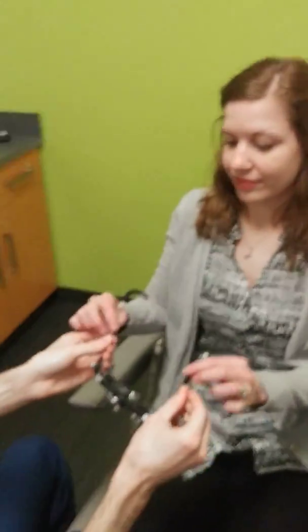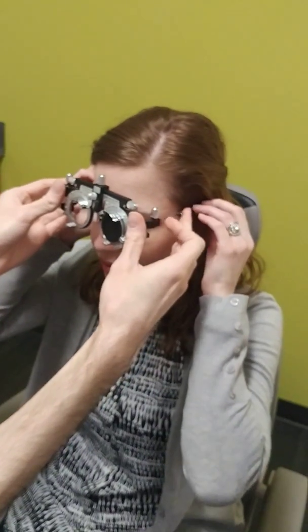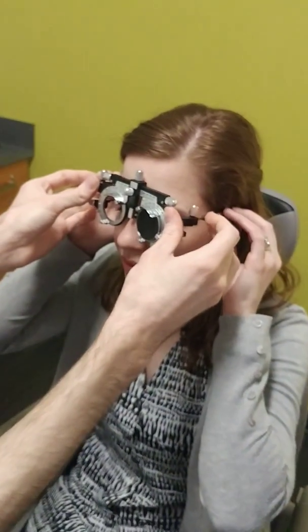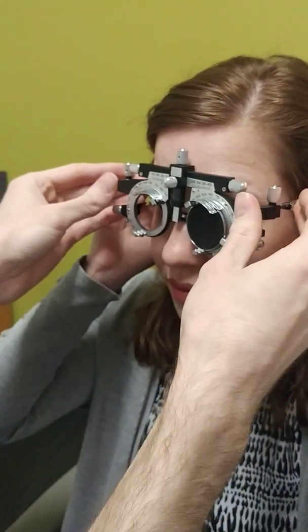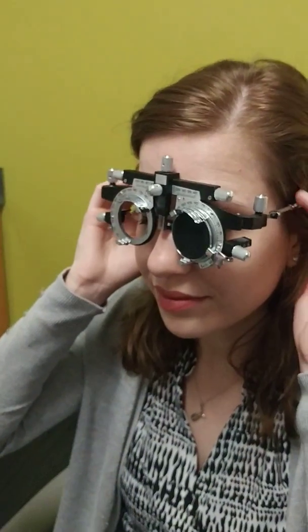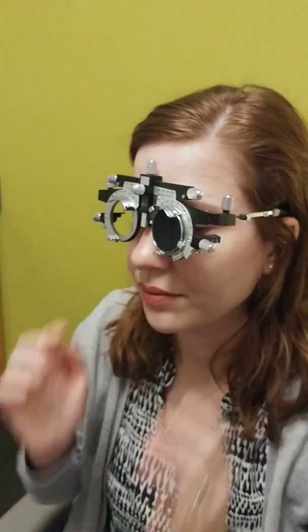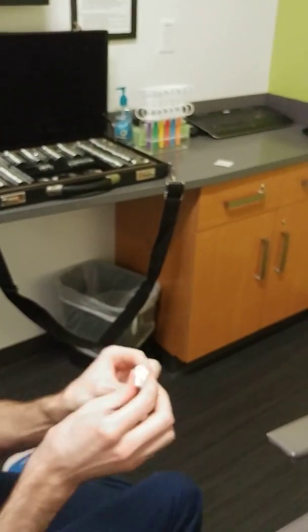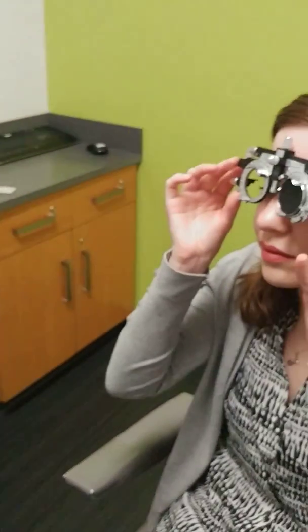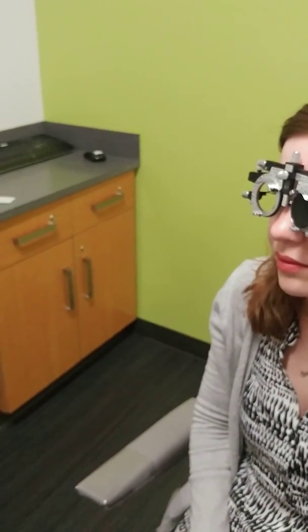With that, I'm going to give these to Jennifer and have her put them over her ears. I like to hold onto the frame while the patient is putting them on so that I can tighten them. Most patients will find these pretty heavy. One thing you can do if the patient complains about the weight is fold a tissue and fit it underneath the nose piece — but you don't want to poke them in the eye.